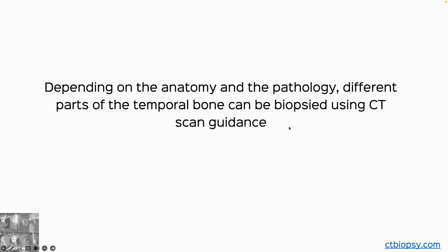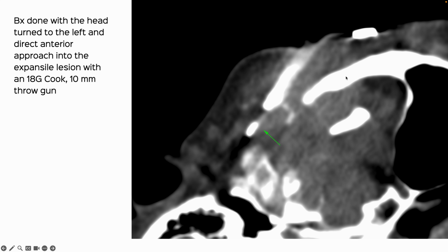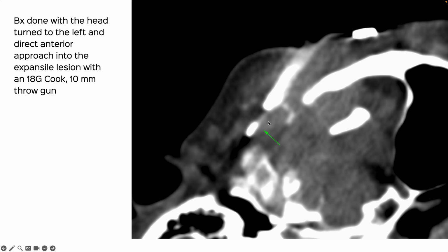I looked at a bunch of my temporal bone biopsies over the last few years and realized that we've done a few and they're not really difficult. Here's a patient with an expansile lesion involving the temporal bone and the posterior zygomatic arch. We've got fluid levels here, which in this region would represent something like a giant cell reparative granuloma. With the head turned towards the opposite side, I just went straight into the osteolytic lesion and biopsied this, and that is what it turned out to be.